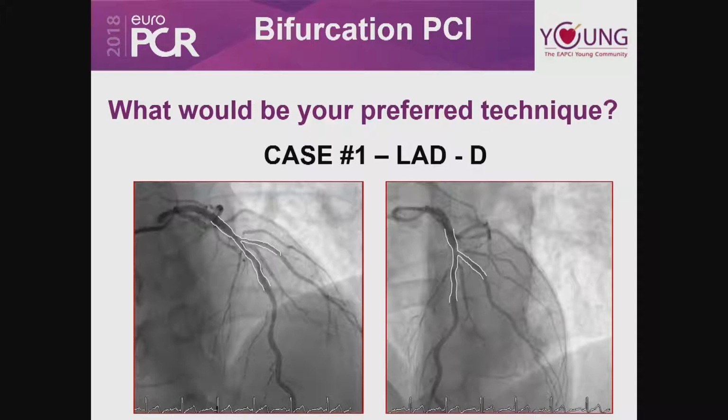Reference diameters. What do we have? When we talk about reference diameter, we are selecting our main branch stent, and we have to first define the reference diameter for the distal main branch. So what would you say? Looks like 3.5. 3.5, 2.75, 3. A lot of discussion.